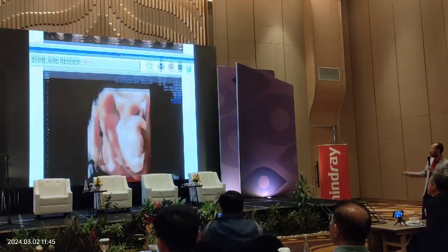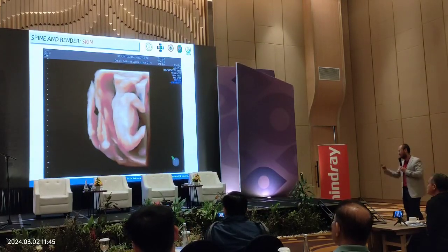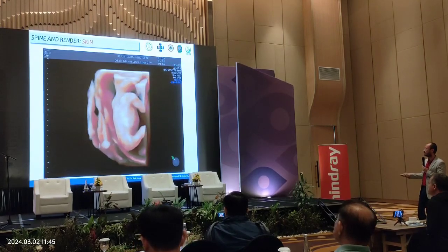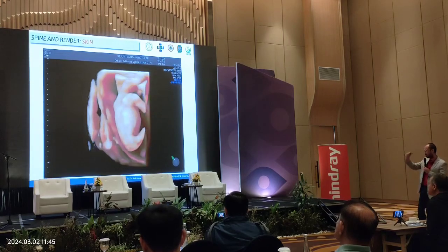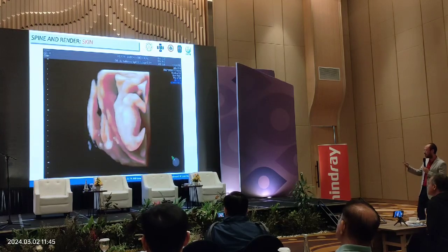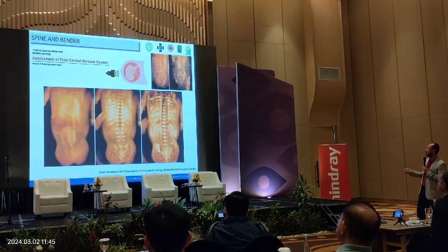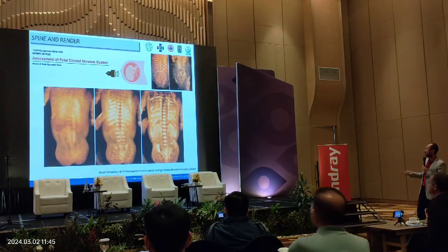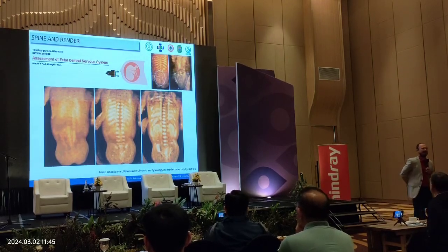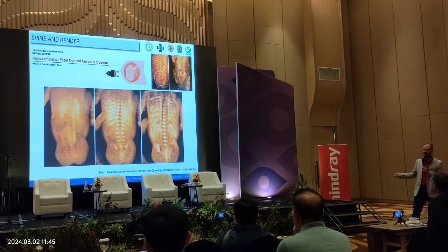Yeah, this is a tomography. I will make it fast. Here we can see the skin is very good, very smooth. There is no hole there. But by using the tomography or the OmniView or CMPR, we can see if there is a problem like this. So seeing open spina bifida by only seeing the skin is sometimes very hard if we are not seeing the bone, the vertebrae.